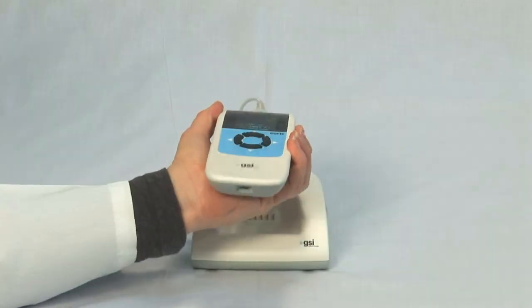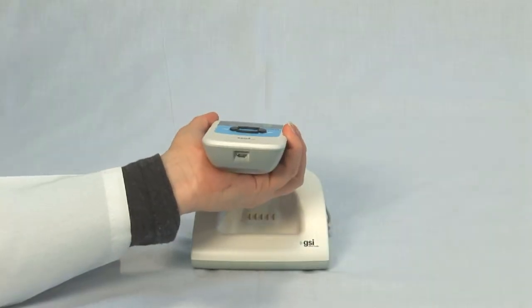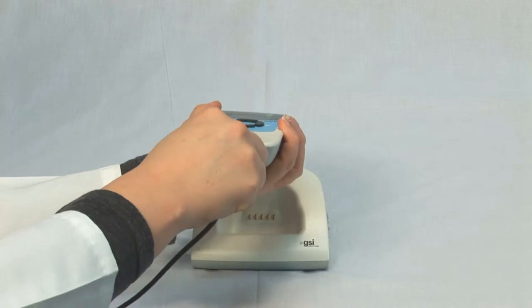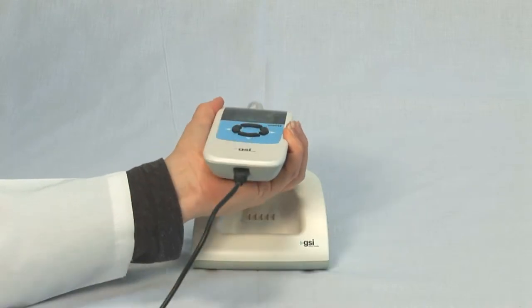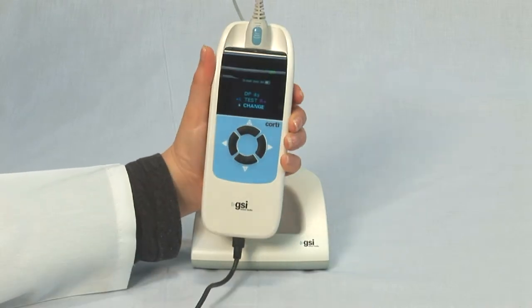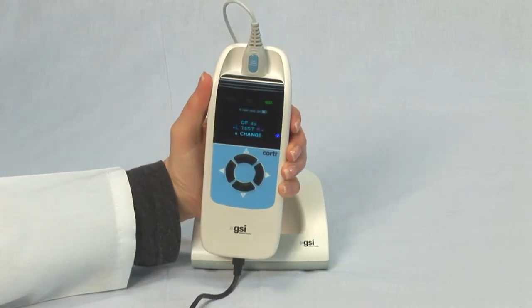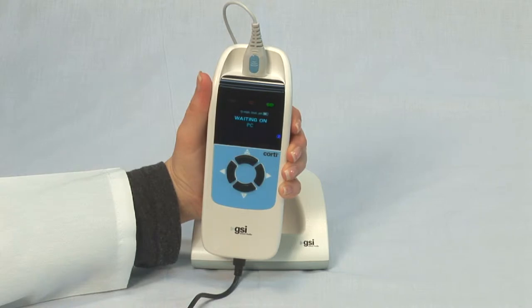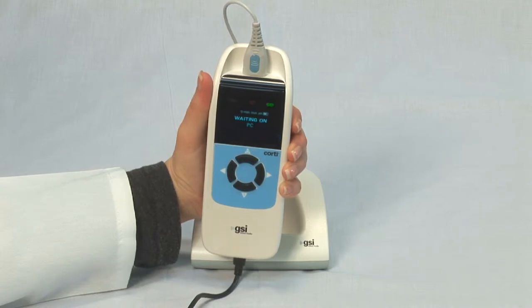First, connect the GSI CORDI to your PC using the micro USB cable. Turn on the CORDI and wait until the screen says Waiting on PC.